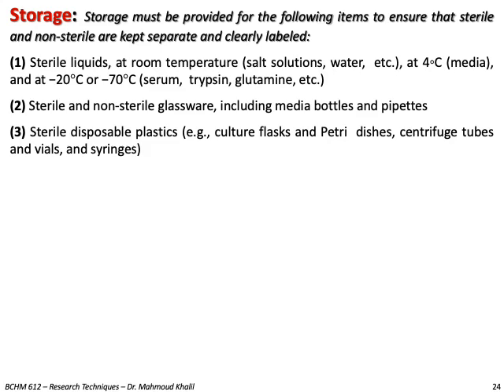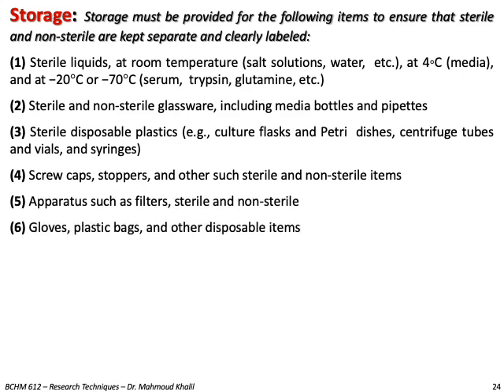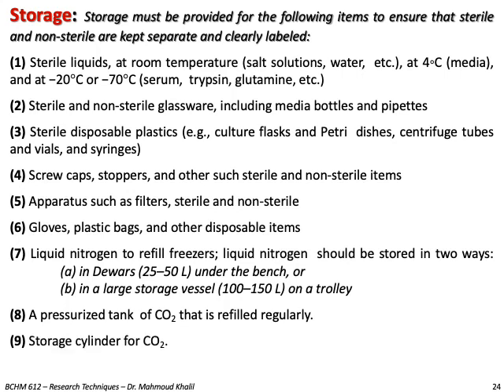Sterile disposable plastics that are used in the cell culture. Screw caps, stoppers, and other such sterile and non-sterile items. Apparatus such as filters, sterile and non-sterile. Gloves, plastic bags, and other disposable items. Liquid nitrogen to refill freezers. Liquid nitrogen should be stored in two ways: in dewars that take up to 50 liters under the bench, or in a large storage vessel up to 150 liters on a trolley. A pressurized tank for carbon dioxide that is refilled regularly. A space for storage cylinders for carbon dioxide.